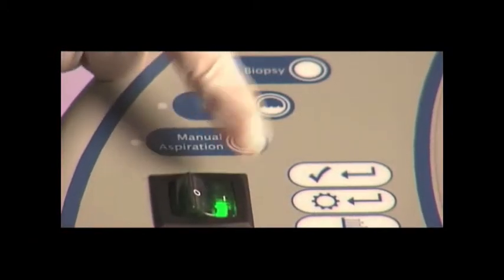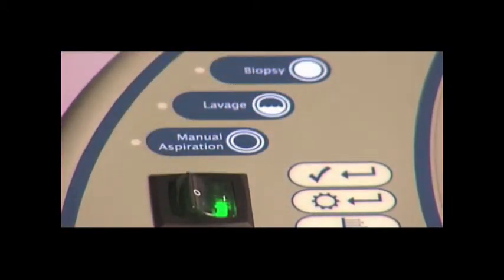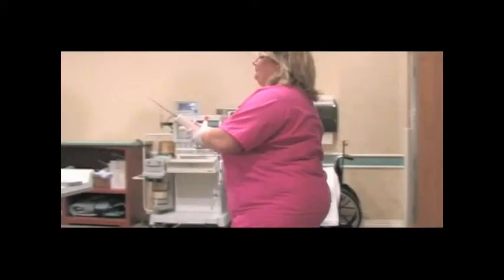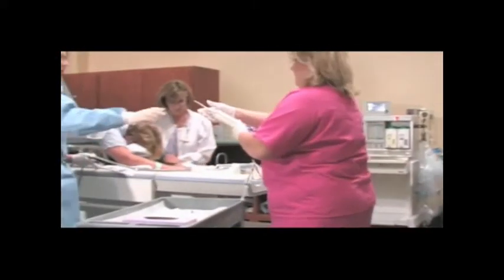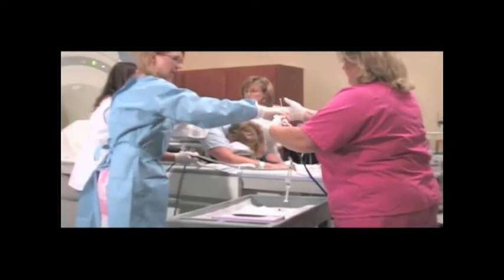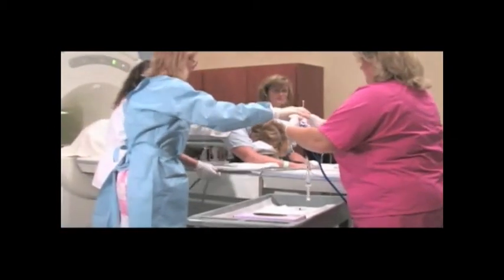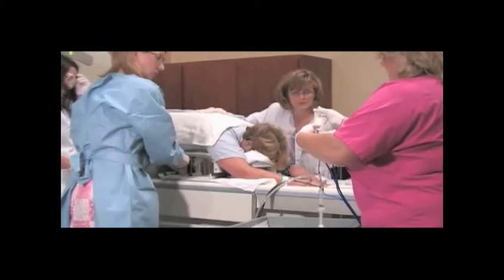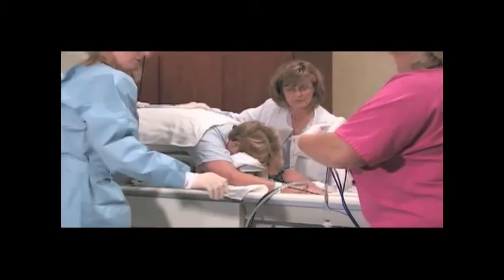Turn the ATEC console on and take the MRI compatible handpiece and foot switch into the MRI suite. The ATEC MRI handpiece is equipped with 20-foot tubing allowing the physician to easily perform the biopsy while maintaining patient safety with the console located just outside of the MRI suite.